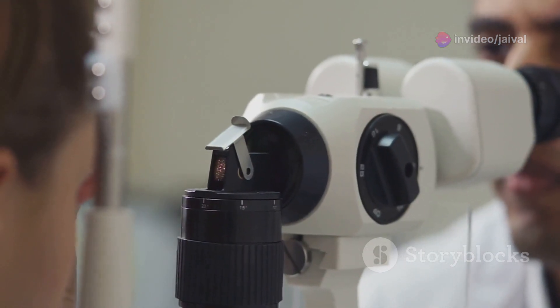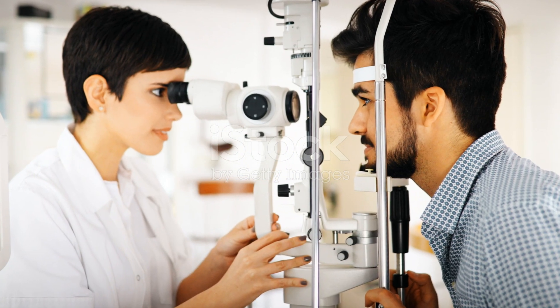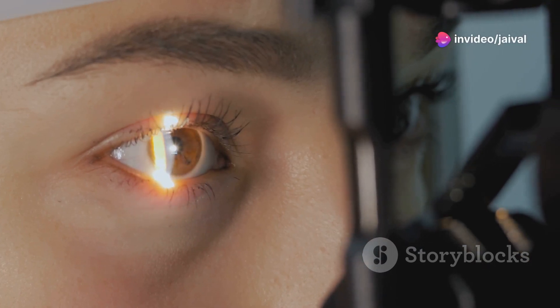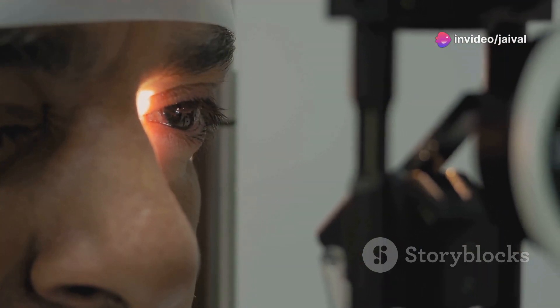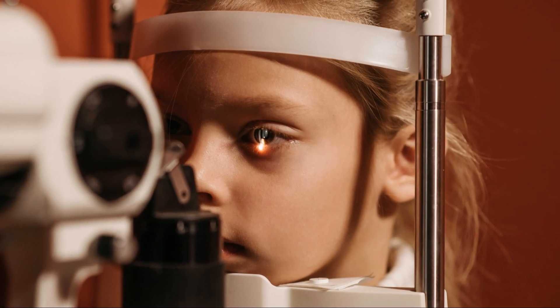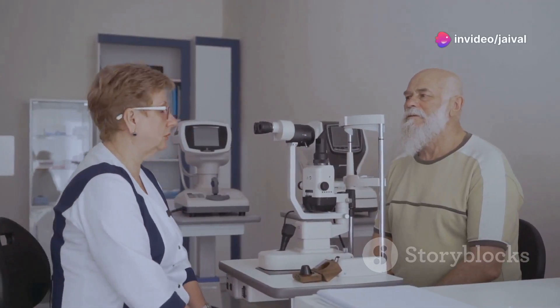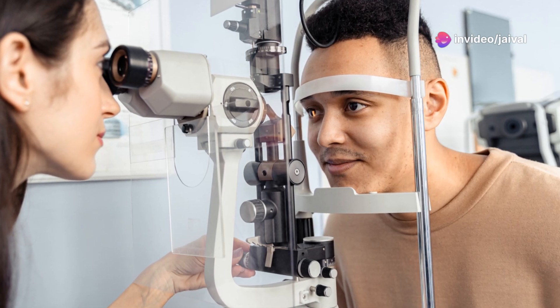With the goniolens in place, visualize the iridocorneal angle and examine the entire circumference, focusing on key landmarks. Identify Schwalbe's line, the trabecular meshwork, and the scleral spur. Assess the ciliary body band and the iris root for abnormalities. Note the angle width, trabecular meshwork pigmentation, and any abnormal vessels. These findings aid in diagnosing and managing glaucoma. Gonioscopy provides essential information for clinical decision making.